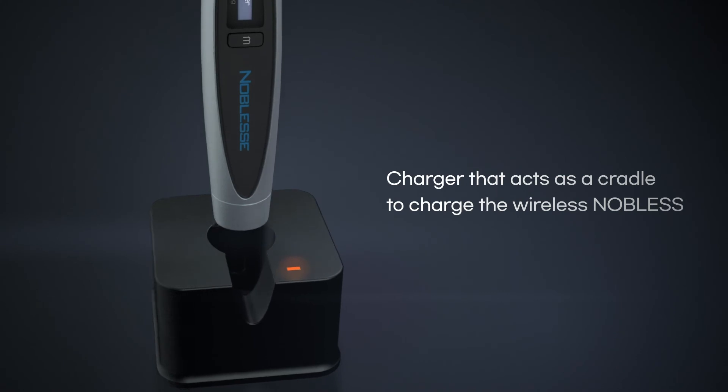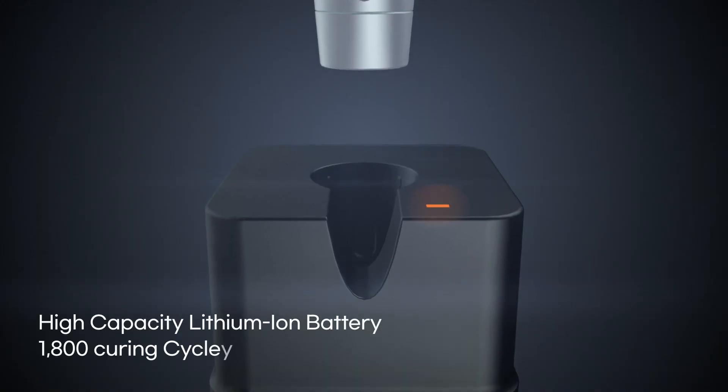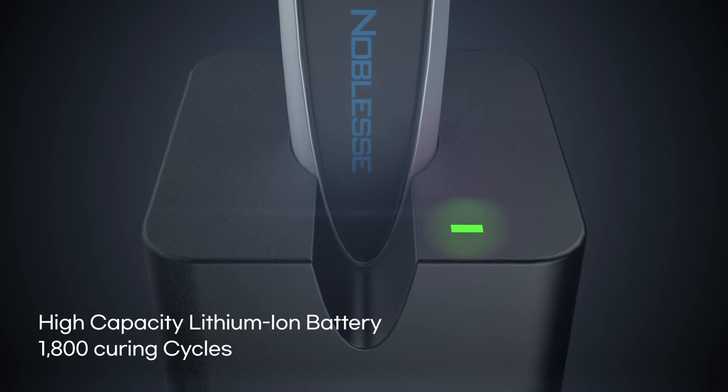Wireless Noblis is supplied with a well-designed sturdy charging cradle. The high-capacity lithium-ion battery is easily charged and provides approximately 1,800 curing cycles on a full charge.